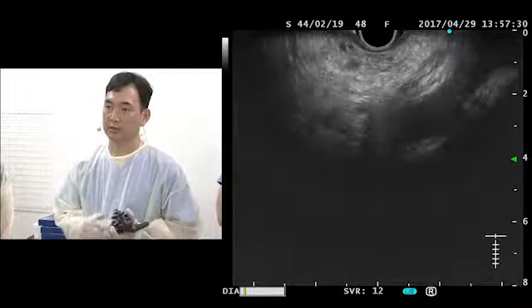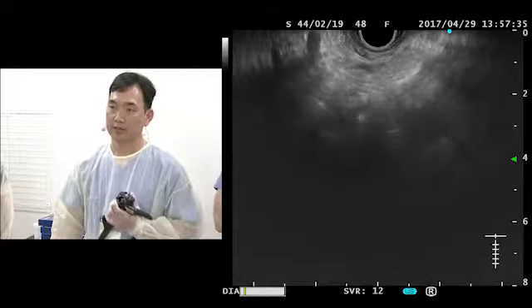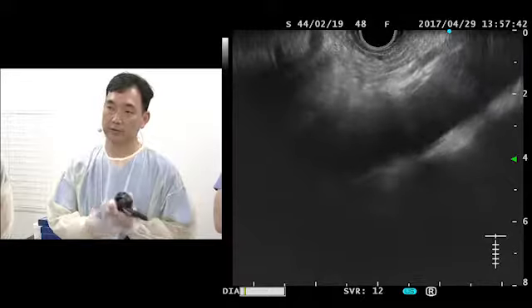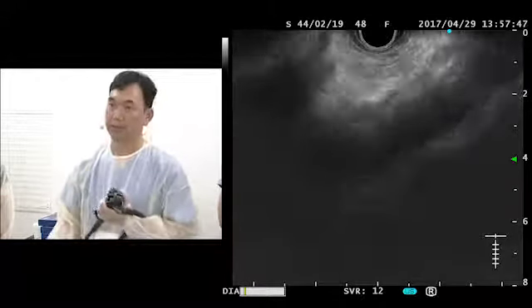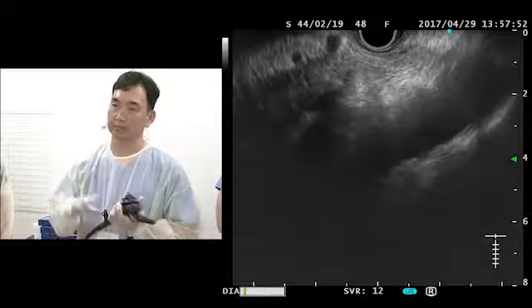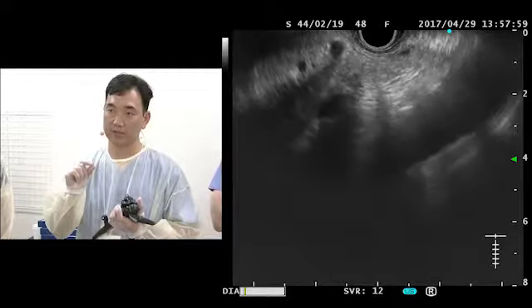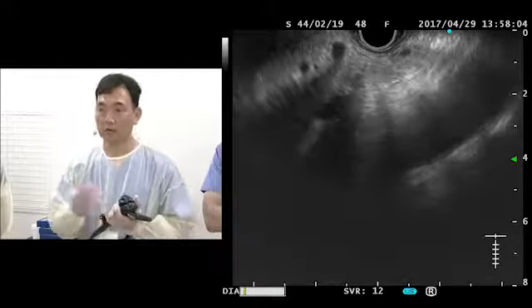The team here checked the IgG4, which was in normal range, and CA19-9 was normal. DuPan was a little bit elevated, but we don't know truly what that really means. So the first step was EUS. I agree with the physicians here. We have to see what type of changes the pancreas parenchyma has, in the pancreas duct, whether a duct penetrating sign can be seen, which signifies an inflammatory process rather than a tumor process.